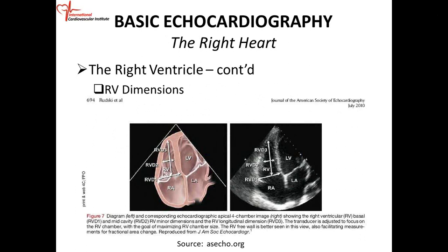Looking at the actual echo — this is an apical four-chamber view. The heart is not going to come labeled, but you can see the tricuspid valve is more apically positioned, lower in the ventricle than the mitral valve. And there's a moderator band right there. You can see the trabeculations — the RV tends to be much more trabeculated — and there are multiple papillary muscles.